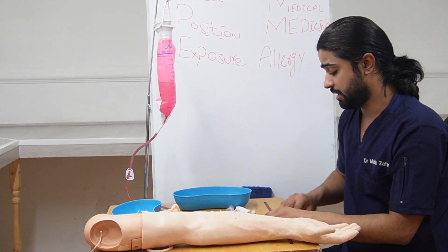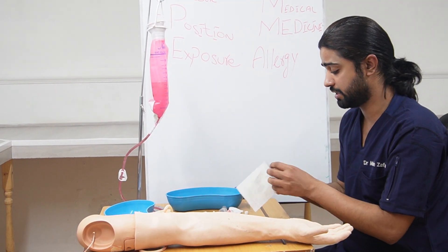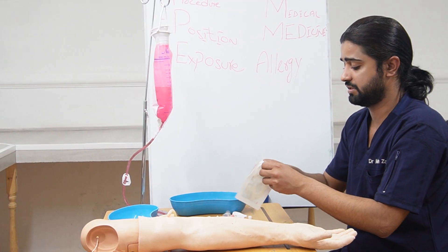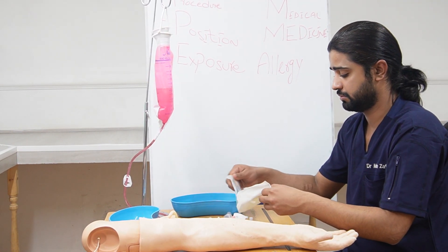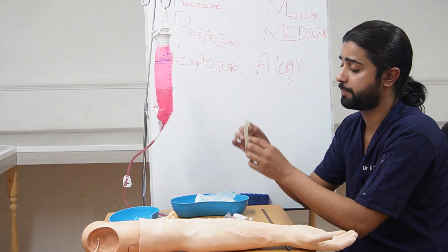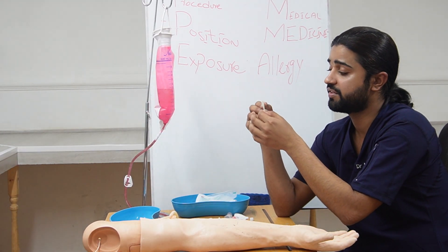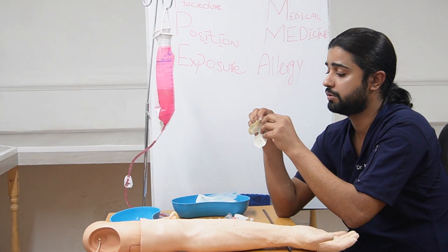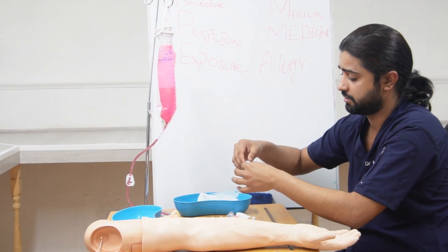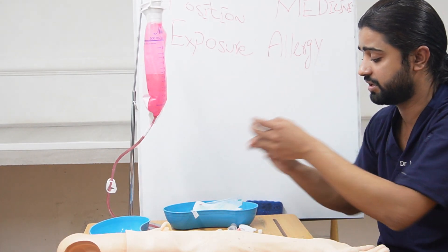Next, I will open the Tegaderm and place it there. In the Tegaderm packaging, you will see a separate small tape. In preparation, you need to take this tape out and stick it to the side of the kidney tray. We will use it to record the time and date of the insertion.